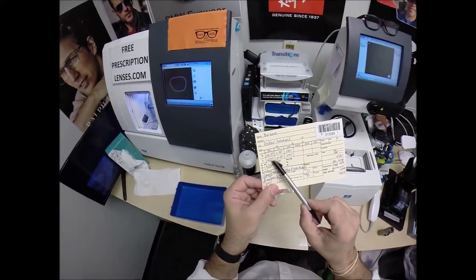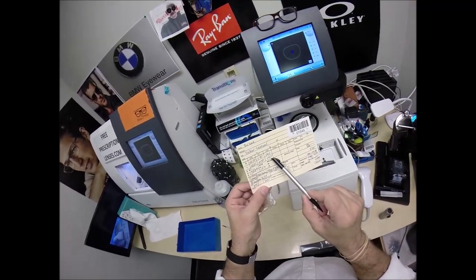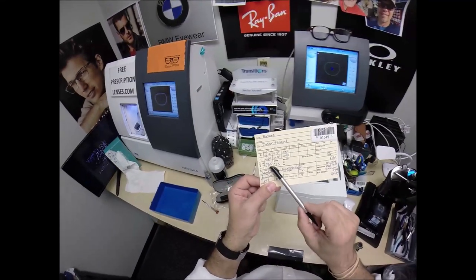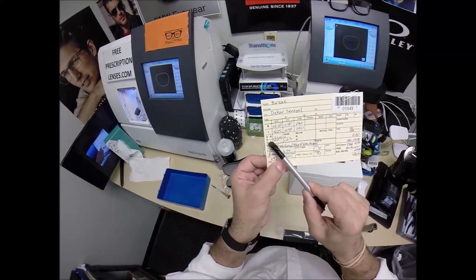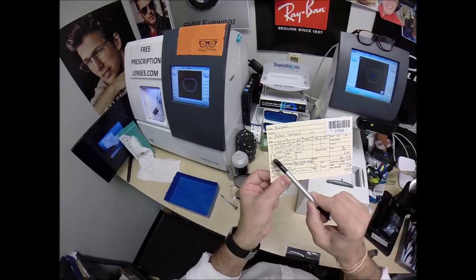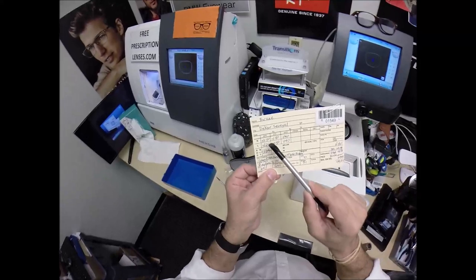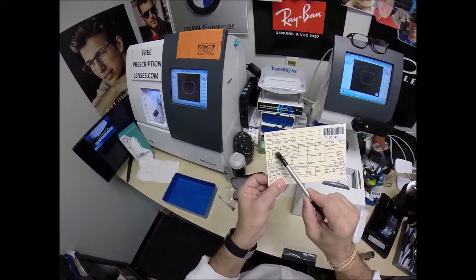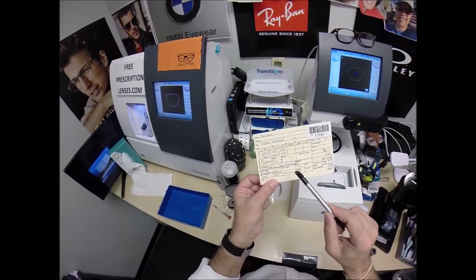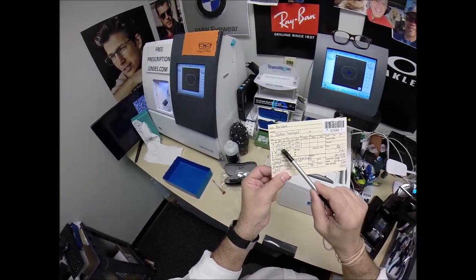Your left eye, you only need nine steps of farsighted correction and only two steps of astigmatism correction, but we still turn that fine-tuned knob to 90. I'm giving you a plus two and a quarter bifocal strength. If you were ever to buy over-the-counter reading glasses, this is called the ADD — progressive additional lens, P-A-L — because it means in addition to what's on top. You have a plus 250 to see far away.